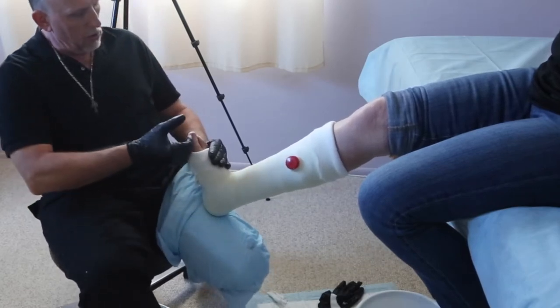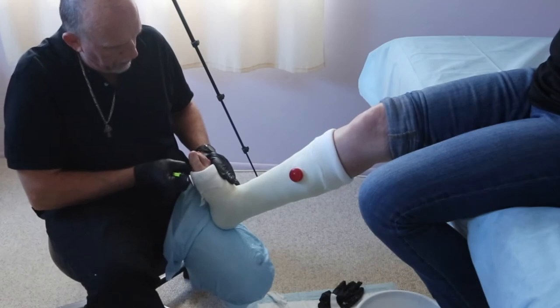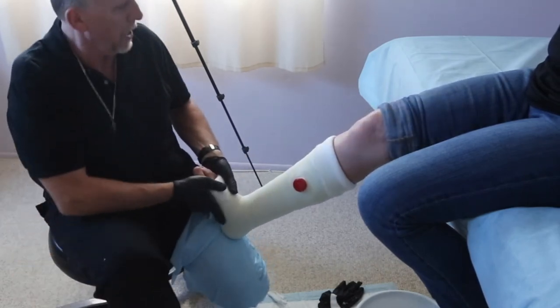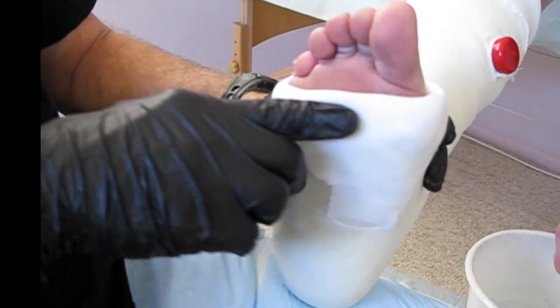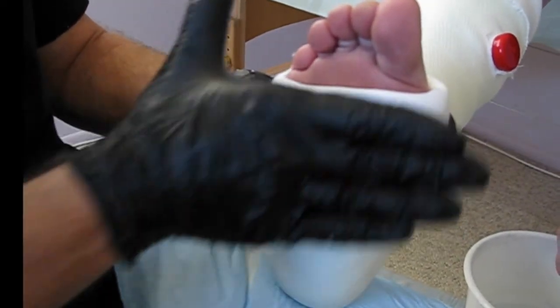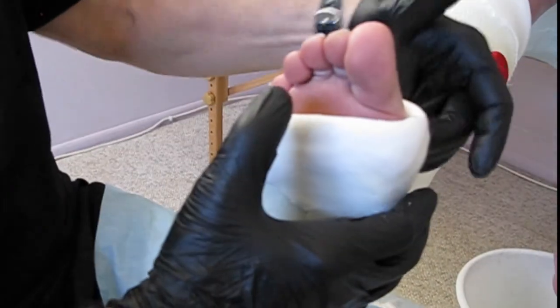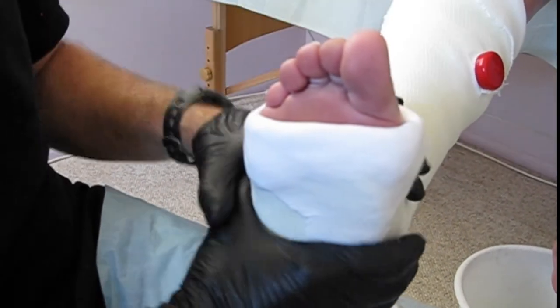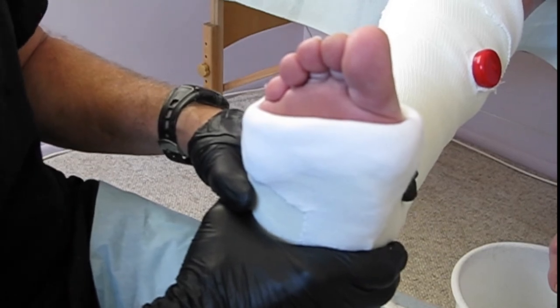And if you did encroach a little high or a little close to it, the pointy scissors — you can very carefully trim this back and get that angle behind the toes. I kind of like what we have. So as we can see, all metatarsal heads are covered and protected, so the toes don't come over the edge and stretch the injured area or the tendons up here. And all five toes are exposed for the patient to keep an eye on them for their size, color, and signs of swelling.